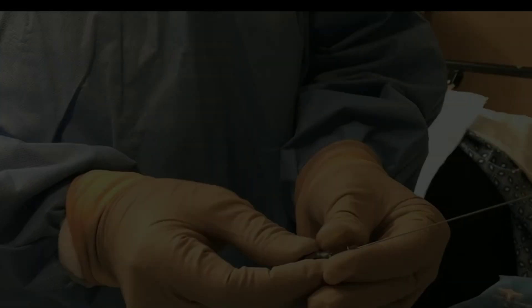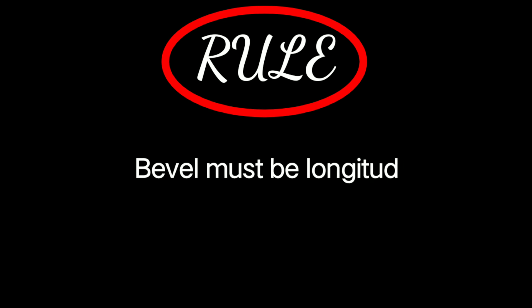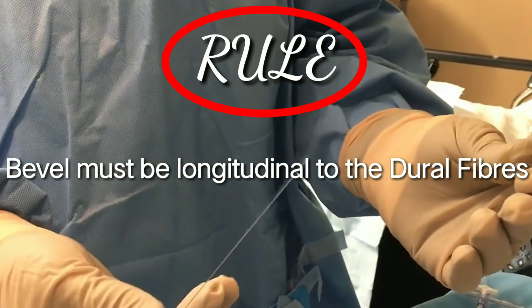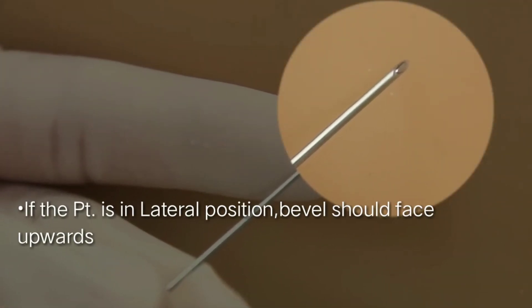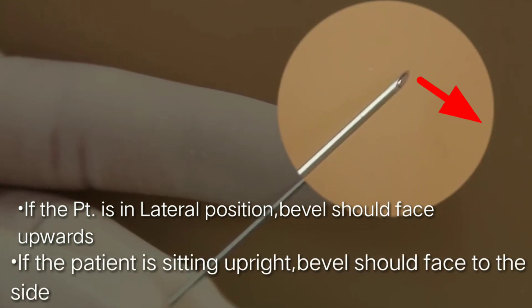A spinal needle comes with a stylet in place, and as a rule the bevel should be placed longitudinally to the dural fibers. If the patient is in the lateral lying position, the bevel should face up; if the patient is in the upright sitting position, the bevel should face sideways.